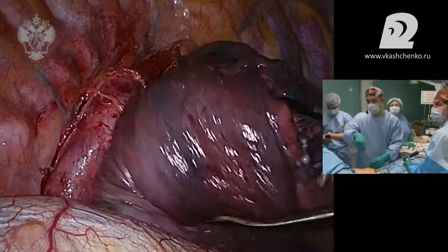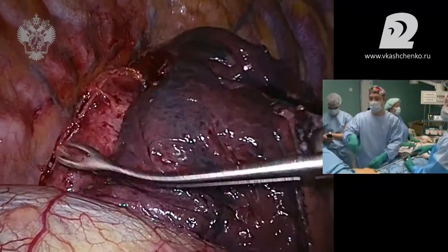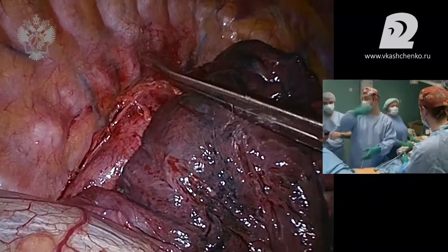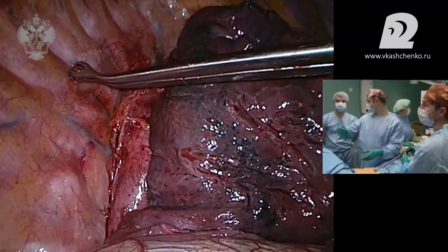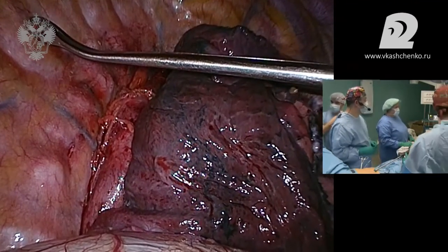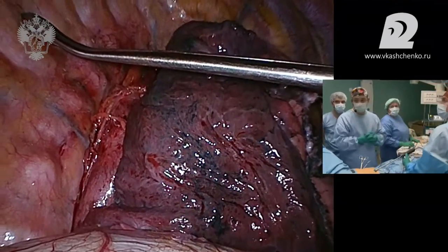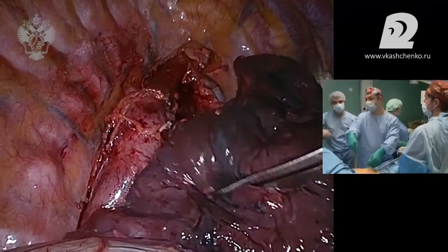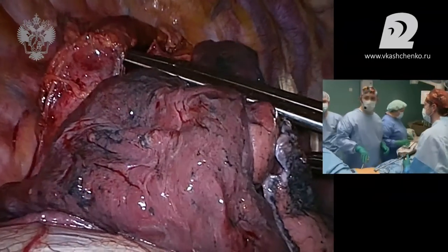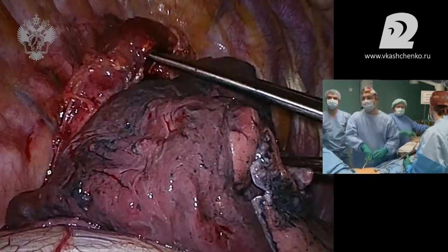Are there any questions? From the floor, probably there are no questions. As soon as we have finished, we will be able to talk. Like this, and there will be the end of the dissection soon. What I need is... 60-45 is not enough. I would like to extract it. Let's bypass it by a sling. Give me a sling, please.